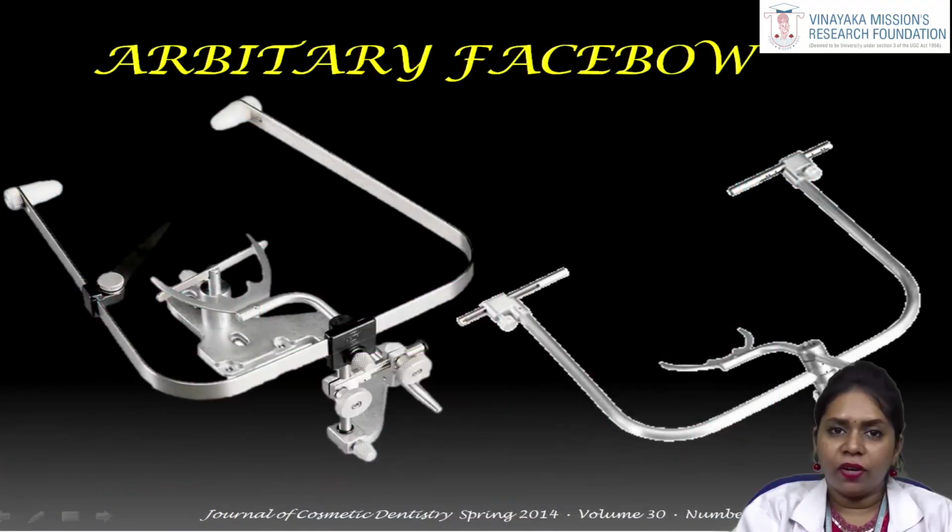The arbitrary face bow relates the approximate condylar axis to the jaw in centric relation. The fascia type uses the posterior reference points to seat the condylar rod onto the skin. This is the main difference between the two types of arbitrary type of face bow.